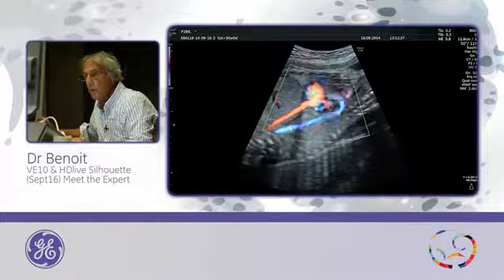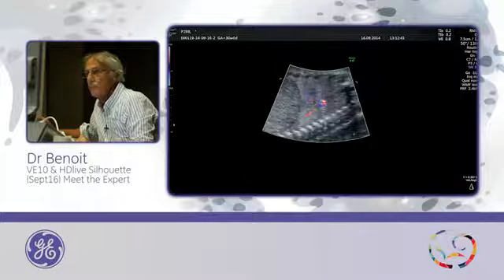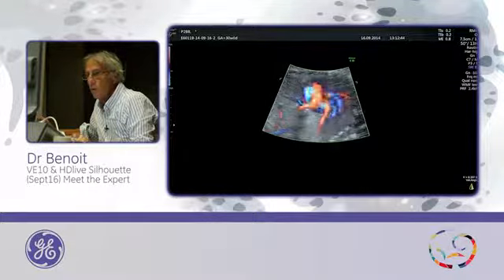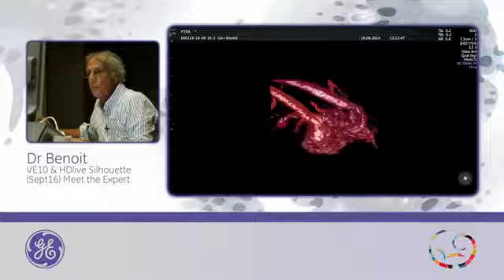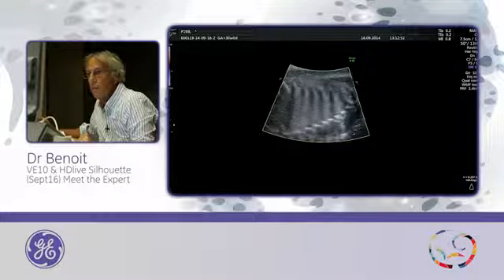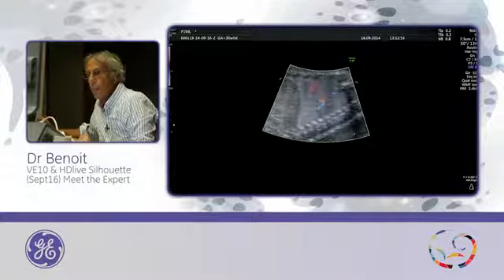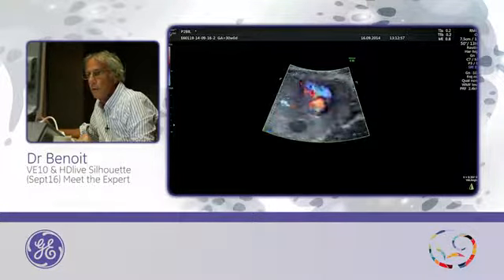Acquisition with 3D. Just the baby moves, so I will do another one. Okay, this one is better.